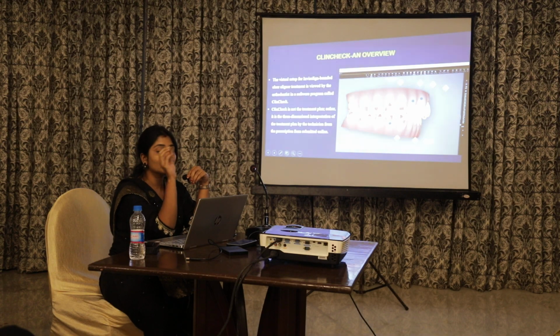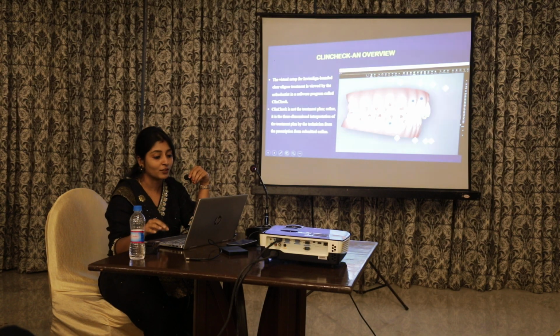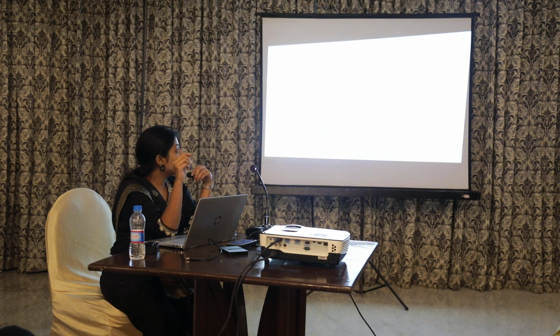It is a setup which has to be viewed by the orthodontist. This virtual setup is formed based on the prescription we submit to them. They ask a set of around 10 questions. For example, sorry for the bad quality of the image, I didn't have a prescription form.